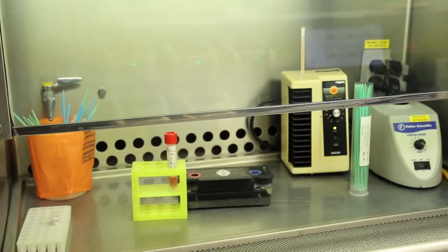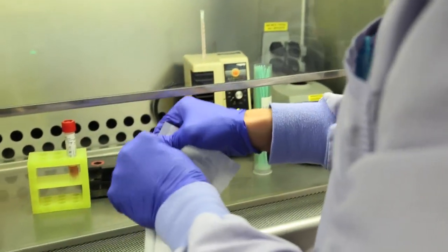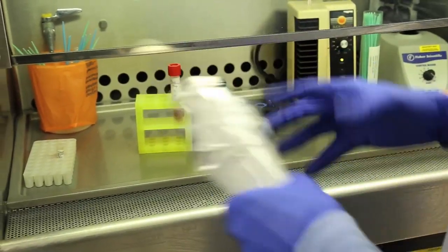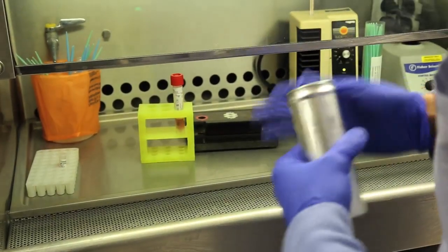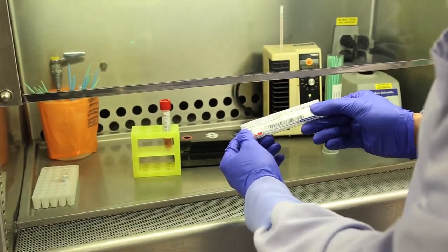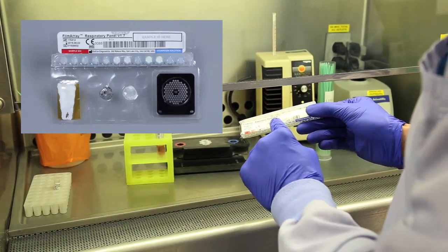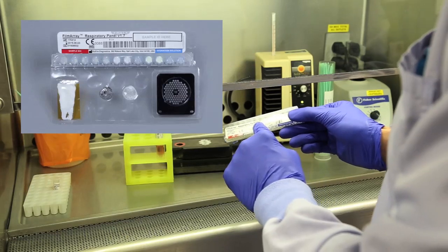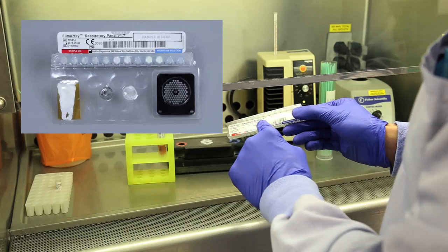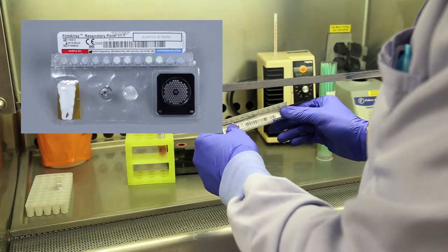Next, we have our pouch. This is a closed system, vacuum sealed in this package. This was the barcode that I had previously mentioned. As you can see, it says respiratory panel. So once we scan this onto the instrument, it should verify that it is a respiratory panel sample we are running. When we are finished, it will pair up anything that was in the specimen against the listed targets that it can run.